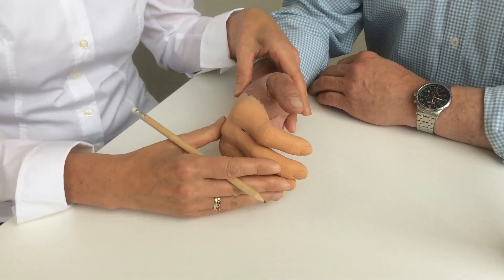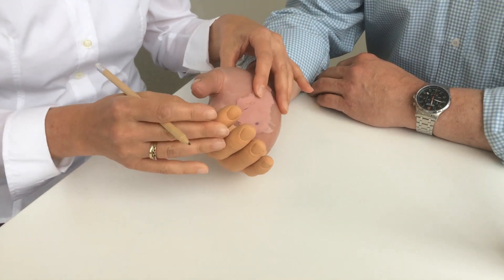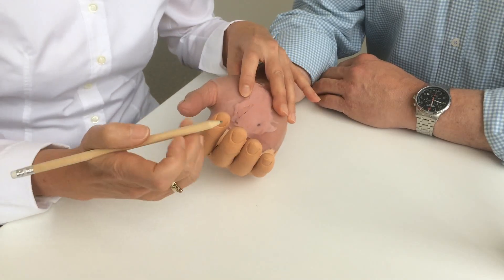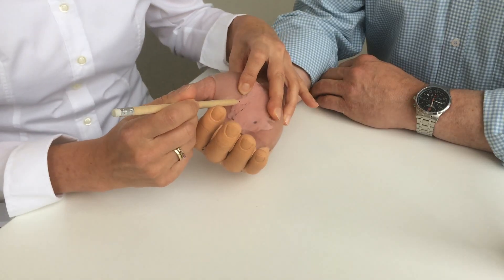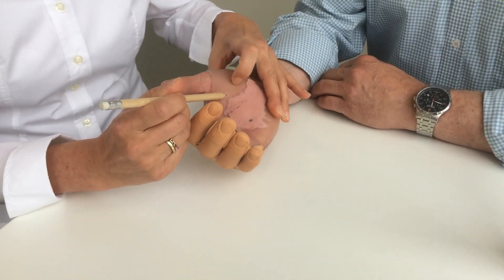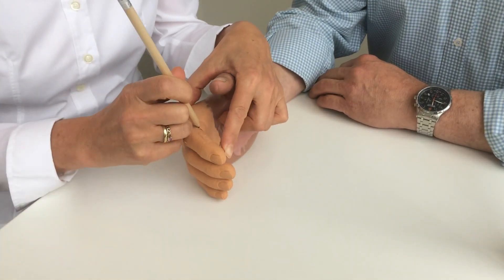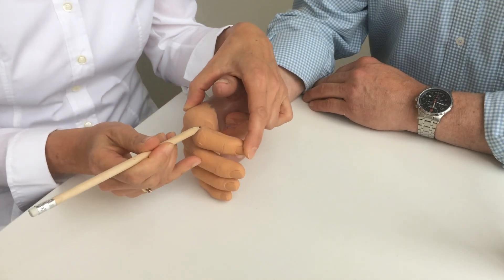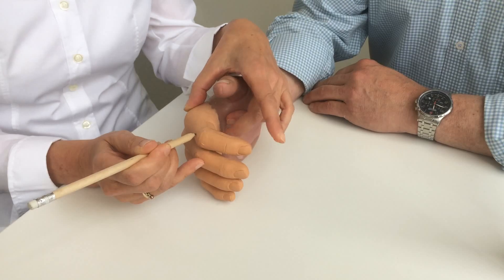Here is the trial prosthesis I've adapted. I've shortened the socket brims, curved the fingers in further, and injected Impressil to remove the air inside the hand. I made sure to smooth the Impressil towards the sides of the prosthesis to avoid hard edges forming. I changed the position of the fingers by cutting a wedge on the palmar side and reinserting it on the dorsal side. I then reseal the entire prosthesis with Pastasil.